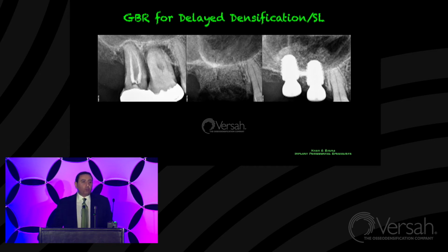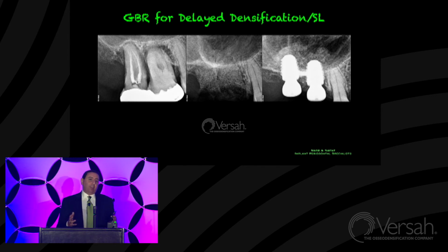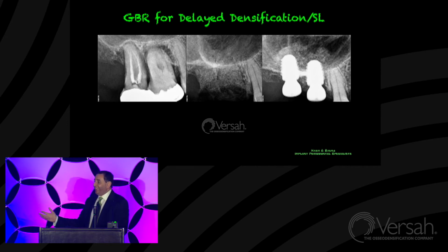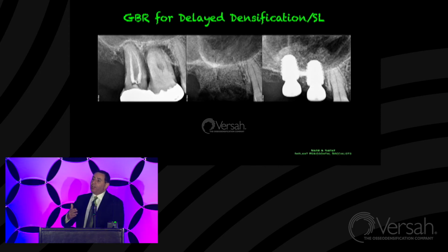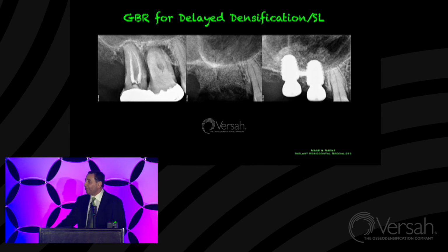a risk. There are some super wide implants which I have ventured into using, and when I pushed the envelope, I paid the price. You engage bone mesiodistally, you engage bone palatally, you engage even bone buccally, and the implant has a 65 ISQ Osstell reading, and you're talking about 55 or 60 newtons, and then you come back and you see a fistula on the buccal surface. Why is that? Because that outer layer of bone is very thin, and it just disappears with those super wide implants. As much as I love them because they anchor, you have to measure the thickness of that buccal plate of bone before you use a super wide implant, because sometime down the road, you're going to pay the price. And the price means free surgery. So obviously, we'd love to help our patients, but we don't want to spend our time doing free surgery, so we want things to work from day one.